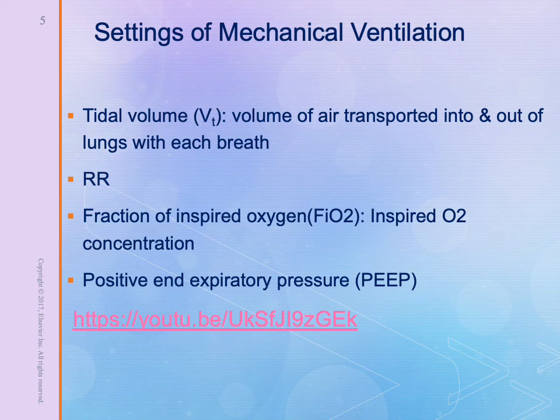The next setting is the fraction of inspired oxygen, or FiO2, which is the concentration of inspired oxygen. This setting may seem familiar to you from your studies on different oxygen delivery devices. Remember that a nasal cannula delivers an FiO2 of 24 to 44% on 1 to 6 liters per minute, and a simple face mask delivers an FiO2 of 35 to 45% at 6 to 12 liters per minute.